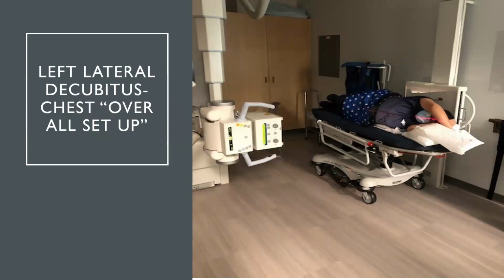Patient preparation. Confirm the patient's identity in 3 ways: wristband or paperwork, and asking the patient to state their name and date of birth. If female, confirm last menstrual cycle date. Confirm with the patient what we are imaging to confirm that the order is correct before imaging the patient. Make sure to shield the patient with the appropriate lead shield if necessary. Make sure to remove all jewelry and metal in the area of interest. Ask the patient to remove the undergarments in the area of interest.